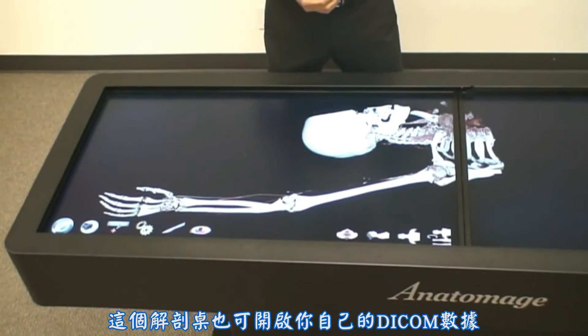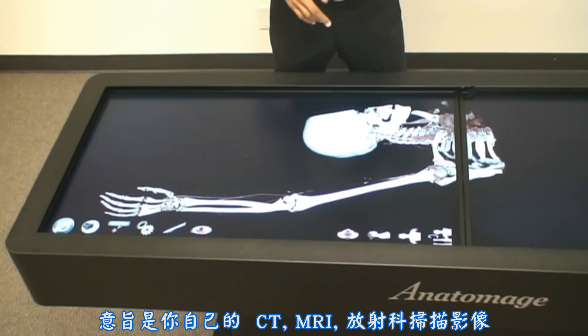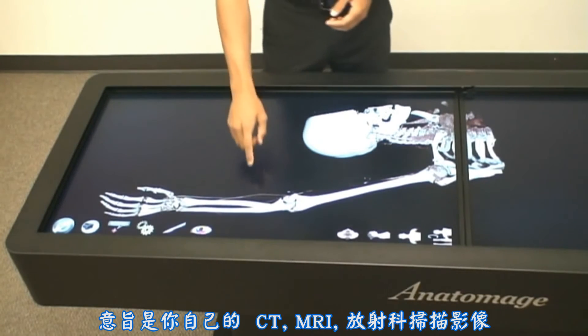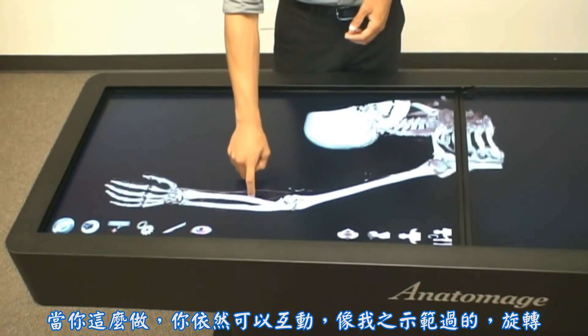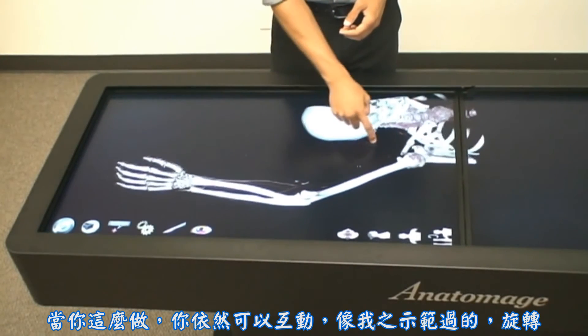The table also allows you to open up your own DICOM datasets, which means you can load in your own CT or MRI radiology scans. When you do that, you're still able to interact with it like before, rotating it in an intuitive way.